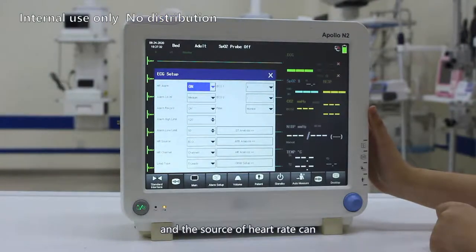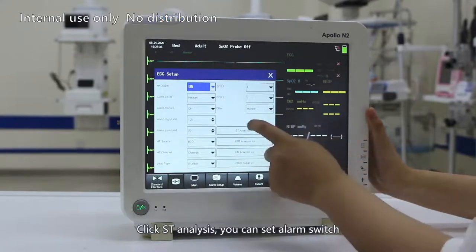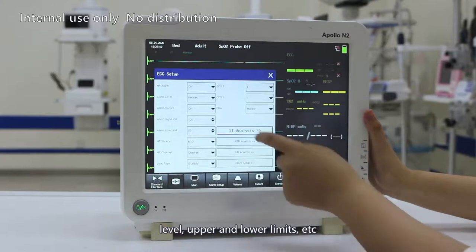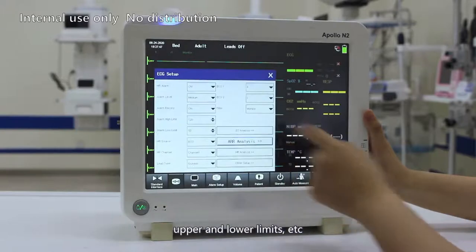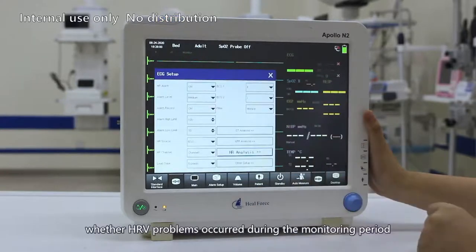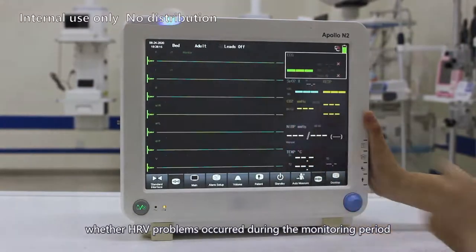And the source of the heart rate can be obtained by selecting ECG or blood oxygen probe. Click ST analysis. You can set the alarm switch, level, upper and lower limits, etc. Click ARR analysis. You can set alarm switch, level, upper and lower limits, etc. Click the setting of the HRV analysis to check whether HRV problems occurred during the monitoring period.